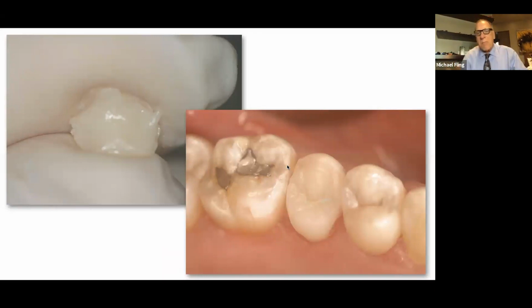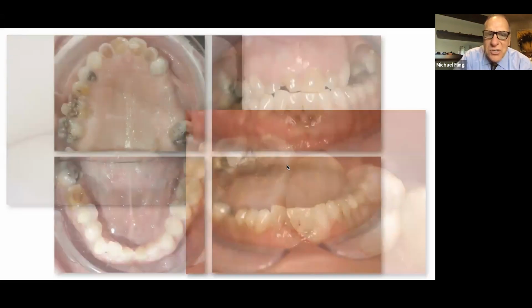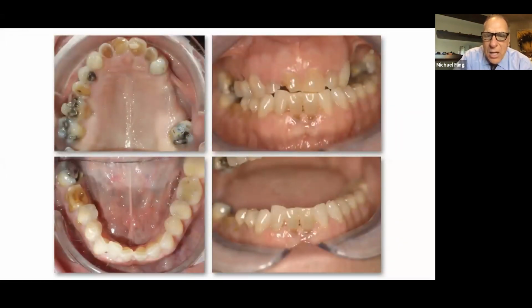It's obviously, most of it is composite filling, but guess what? I contend that is as stable or more stable than if I were doing a root canal, a post and core, and a crown. And we've done this at a fraction of the cost of those other things. So I think it's just a really neat technique. Take a look at this case.